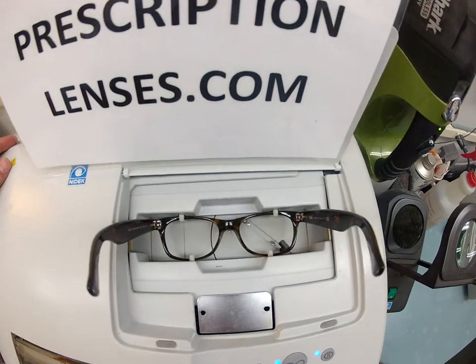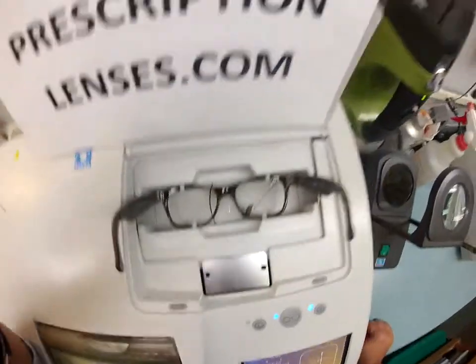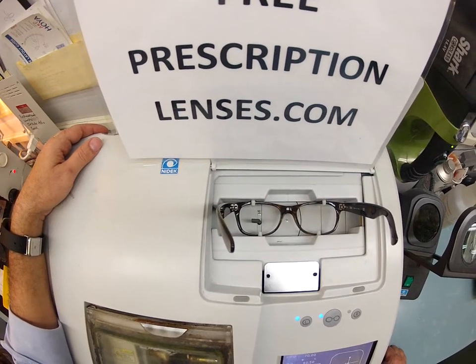The first thing that's gonna happen is it's gonna trace the shape of your right lens — make sure all this is in view — and now it's gonna trace the shape of your left lens.